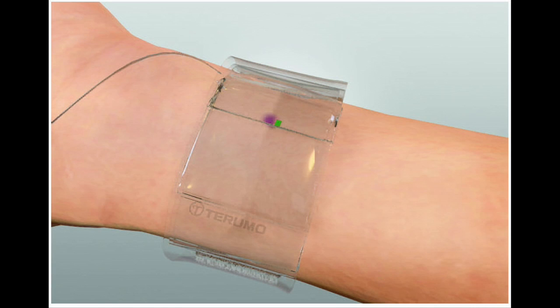After the procedure, the little sheath that is in the wrist is removed and a special Velcro wristband is attached to the wrist with an inflatable cuff located over the area where the radial artery is. The cuff over the radial artery is inflated. It applies pressure to the puncture hole and allows it to seal up over a period of 1 to 4 hours.